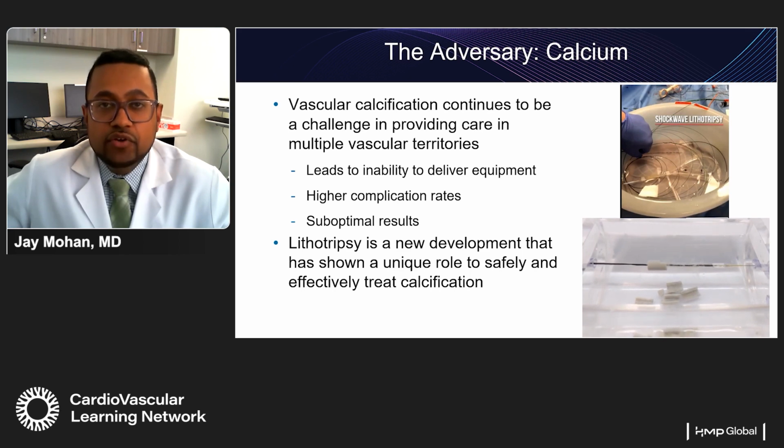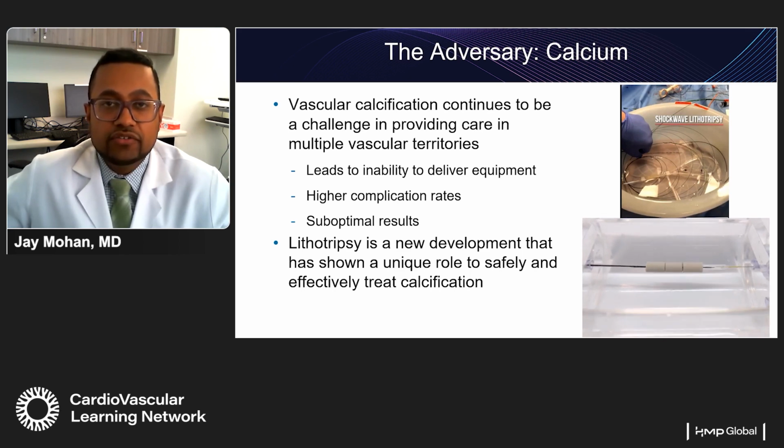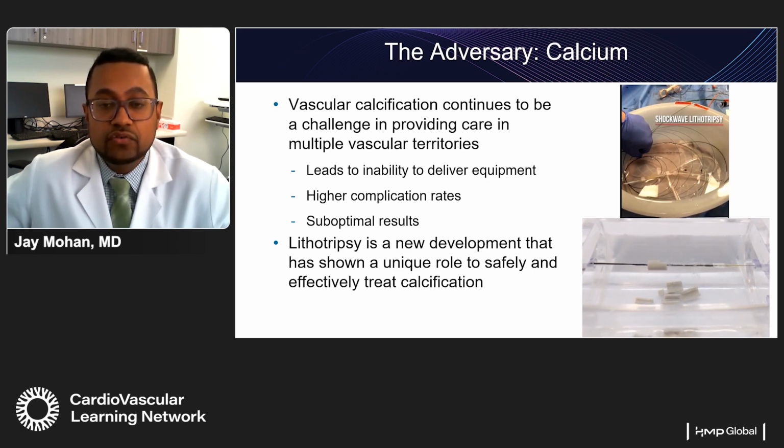Lithotripsy has been a new development in the coronary, endovascular, and structural heart fields. What's been really amazing about it is that it can safely and effectively treat calcium, leading to much improved outcomes, and more importantly, our ability to do these procedures safely.